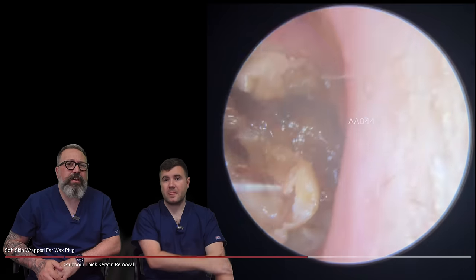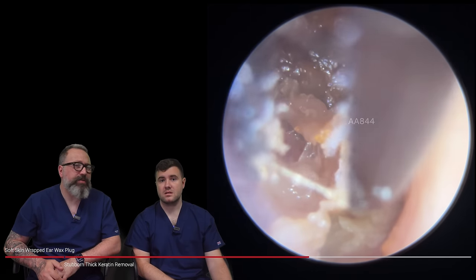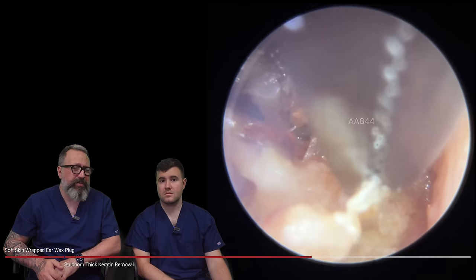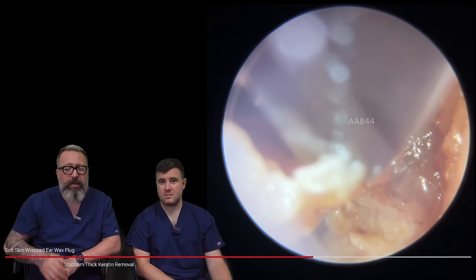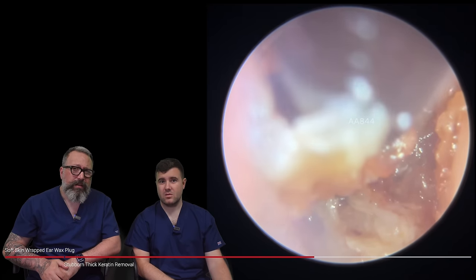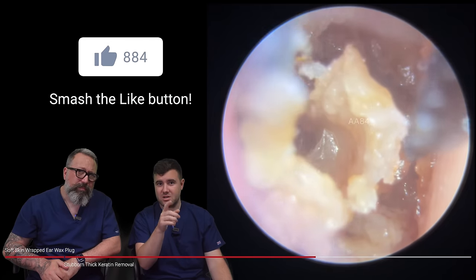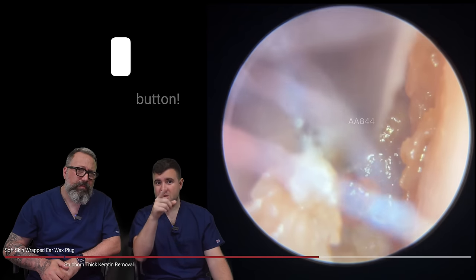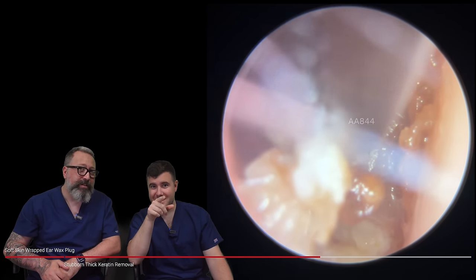No discomfort at all. If the patient is uncomfortable, you need to stop — the patient needs to soften their wax, go away and come back. Don't try and get everything out in the first attempt if it's uncomfortable. Let them go away with a good experience, soften it up, and get them back in a week later. You can see the little bits on the side starting to look over the forceps. We are moving it — gently, gently — I think it's going to break away.